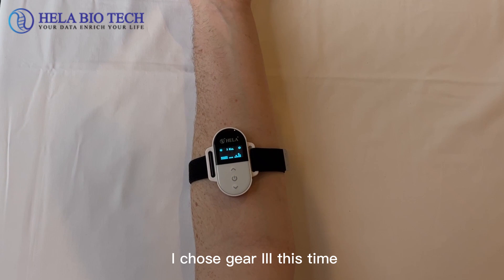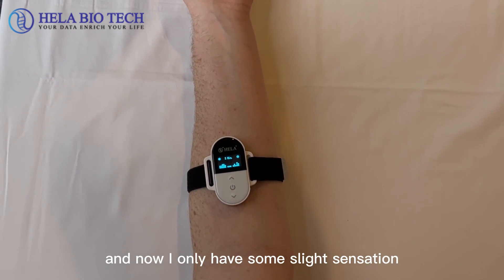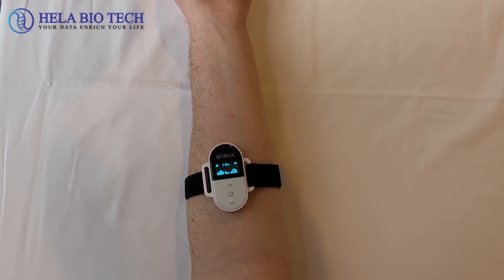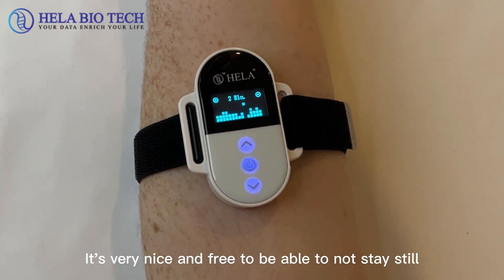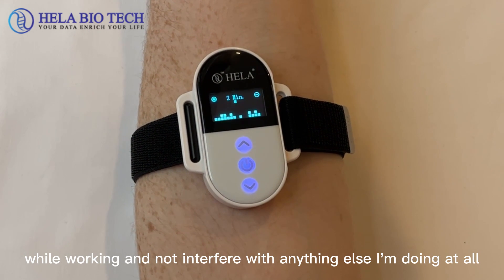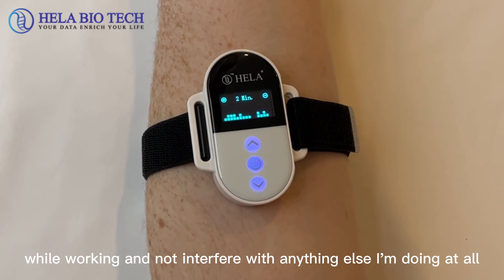We choose gear 3 at this time. Right now I only have some slight sensation, but not at all painful. It's very nice and freeing to be able to keep working and not interfere with anything else I'm doing at all.